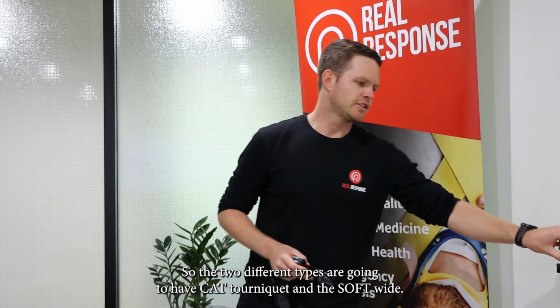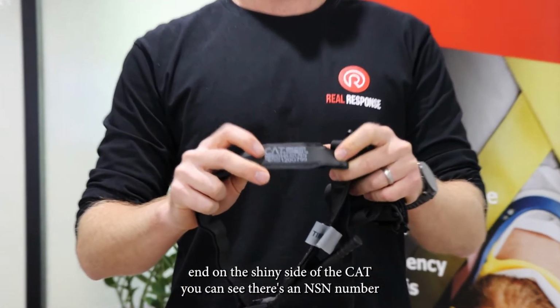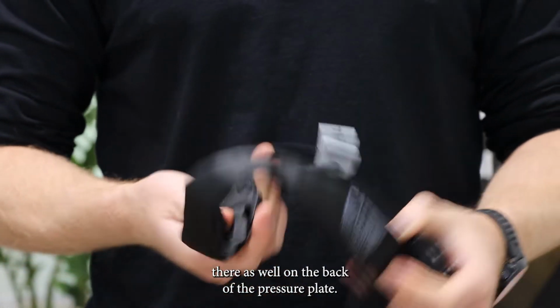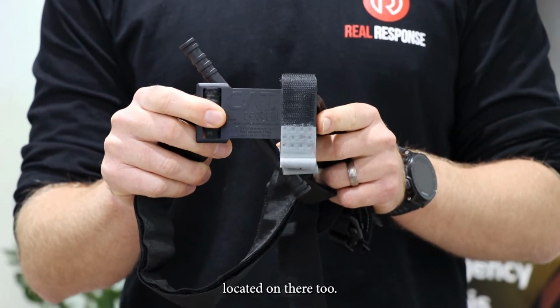located on them. So the two different types, we're going to have the CAT tourniquet and the SOFTT Wide. And what you're going to be looking for is, first of all, on the tail end, on the shiny side of the CAT, you can see there's an NSN number there. As well, on the back of the pressure plate, you can see there's an imprinted logo saying CAT with a few numbers located on there too.